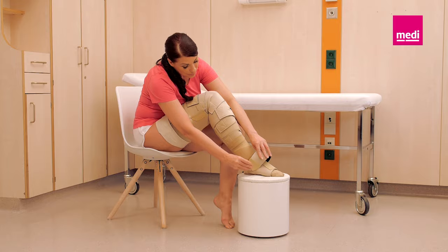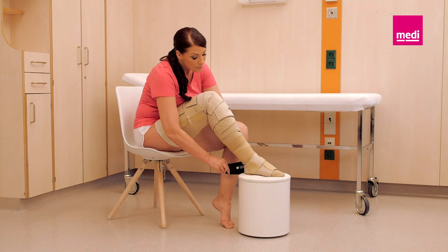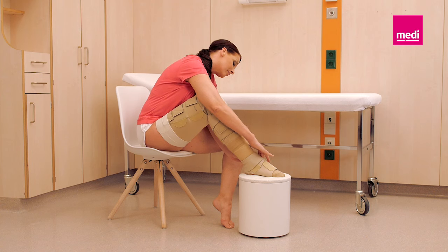If parts of the leg require additional support or there is a gap between components, use the reduction kit shelf strap as needed. The shelf strap can be customized into as many as three different straps once cut to meet the patient's needs. Attach the provided tabs to both ends of the strap and secure it to the outside of the component.